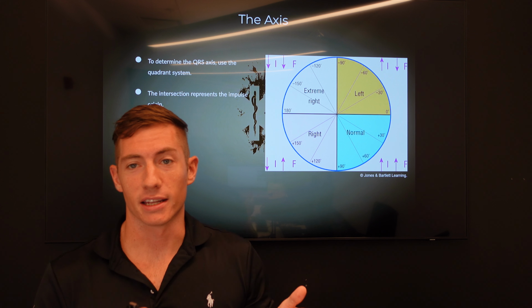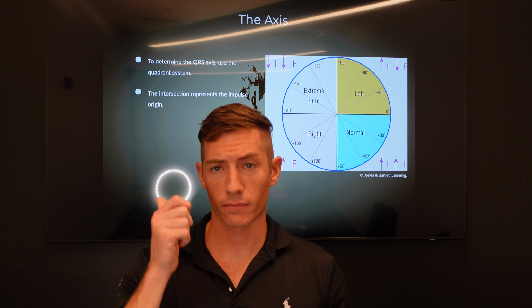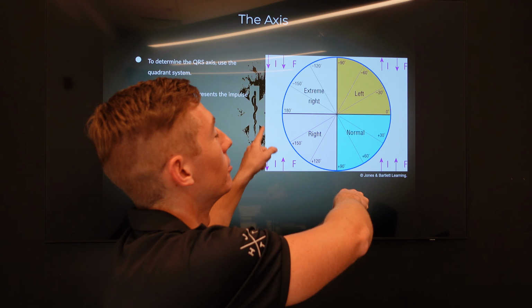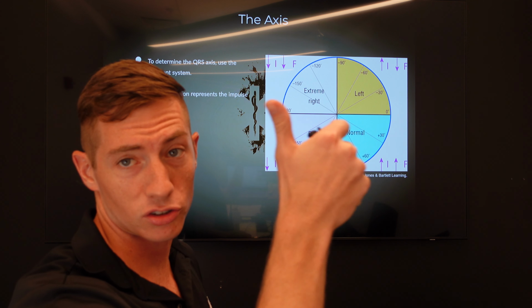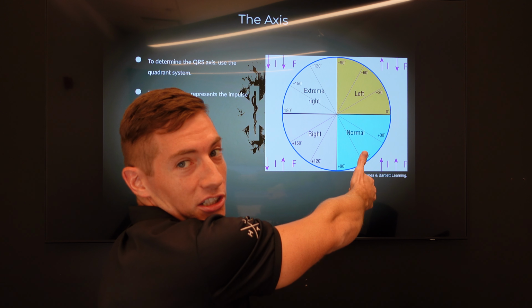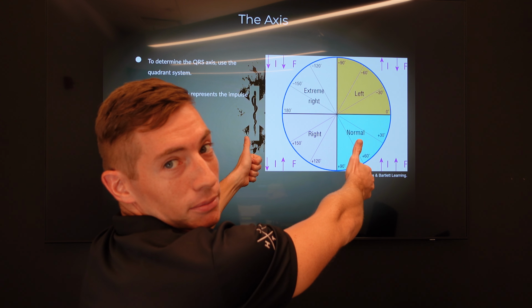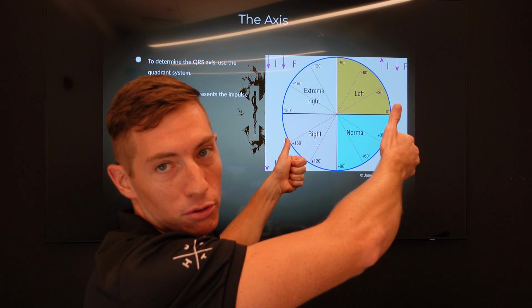So with that being said, I'm going to try, I messed this up on the first video. We need to look at lead 1, which is going to be our right hand. We're going to do this from the perspective of looking at the heart from the anatomical view. So lead 1 is our right hand, and thumbs up means QRS is going up. Pretend like we're driving a steering wheel, and our left hand is going to be our AVF. So if that's positive, then we're both going thumbs up, normal. Electricity is going in the normal direction, good, both thumbs up.